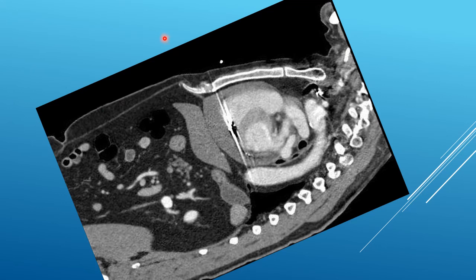So typically we go in at a 45-degree angle so we can be close to the sternal margin and get underneath it. And then we take a shallower track to get to the pericardial fluid. But this area is full of fibrous tissue and it's quite a tough area, and changing the needle track is not straightforward, and these factors are exacerbated by the length of the needle.